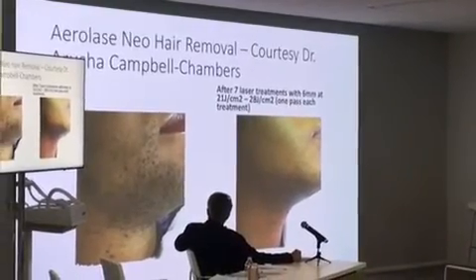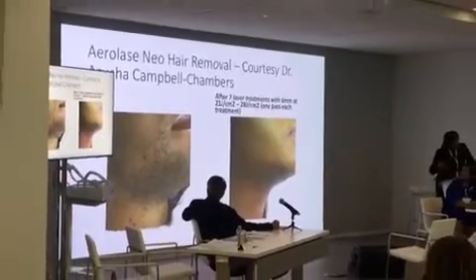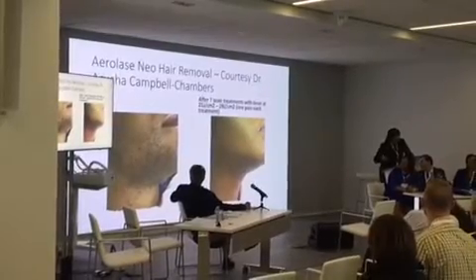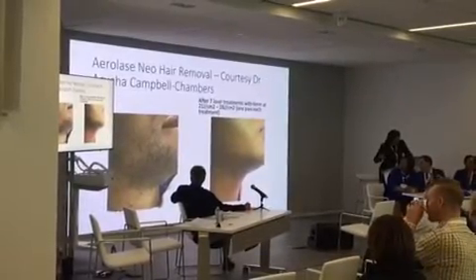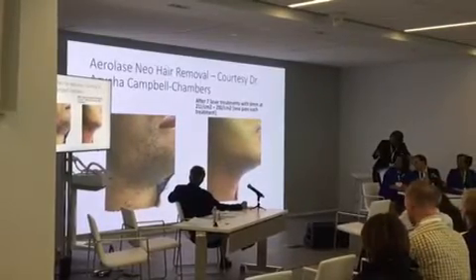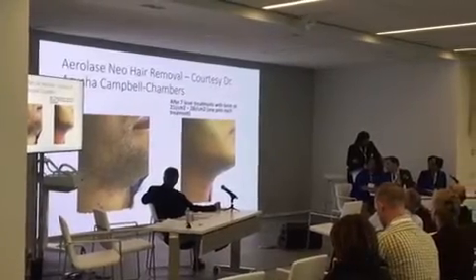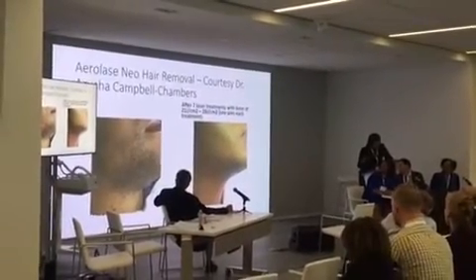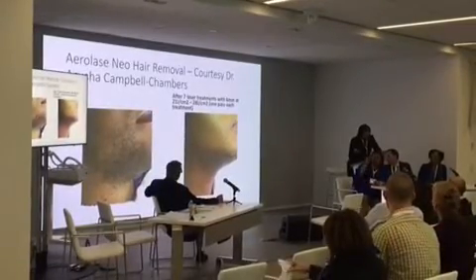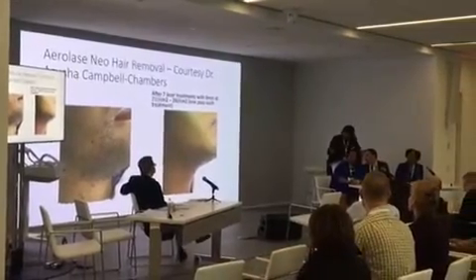As Fran said, the settings I find are quite conservative and very safe, but don't be afraid, once you test them before, to go higher. Oftentimes you can go higher, because as you go along, the hairs get thinner and you need to go higher to get more efficacy. By the 3rd, 4th, 5th treatment, I can go at a setting 7 or 8 quite safely in skin of color. And even in a skin type 5, you can whip out the 5mm lens quite safely as well.